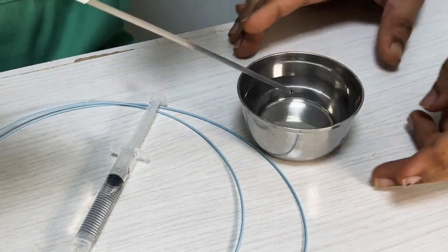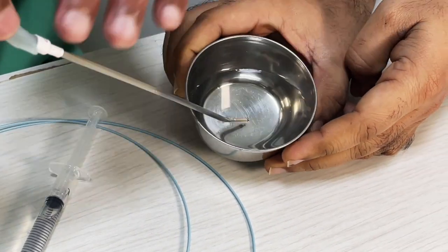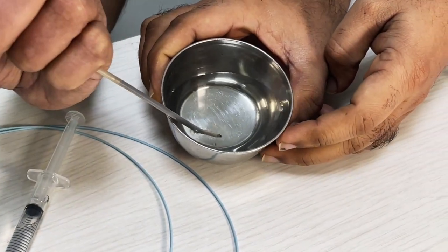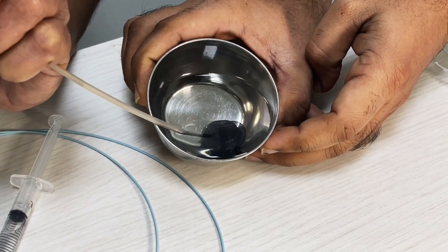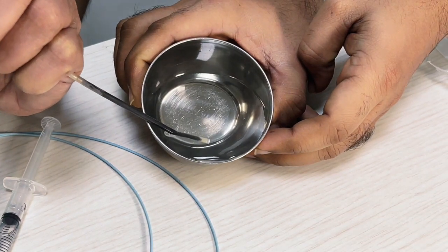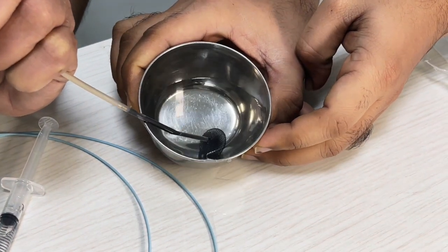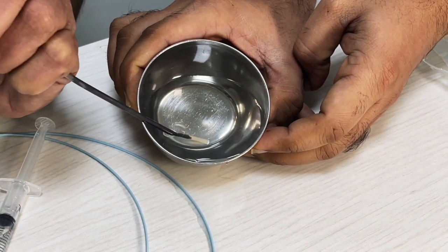Just tilt it and hold it. Tilt it nicely for them to see. Okay, so why do we do this? When you push out, I want to show you something, air bubbles come out. There are air bubbles that are trapped. So you'll do this a couple of times inside, push it out and pull it in, so all the air bubbles are squeezed out, right?